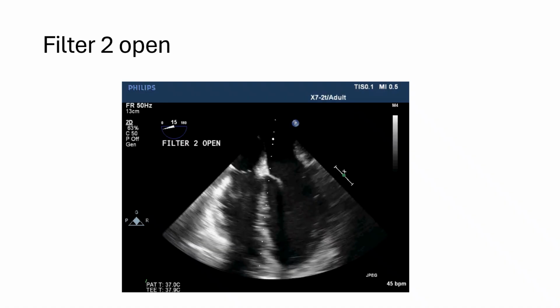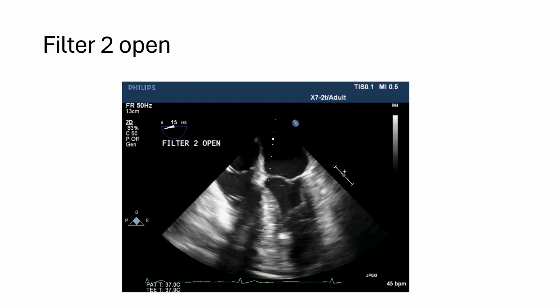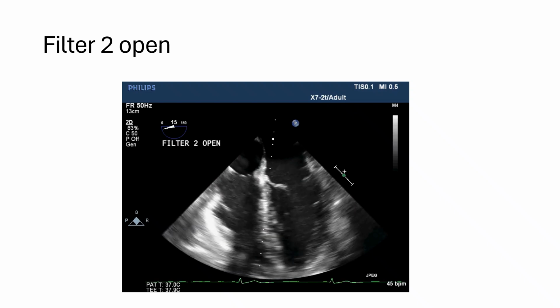And that's despite ongoing vasopressor support with boluses of epinephrine and vasopressin. Once we started to overcome the deficiency in preload, the amount of pressor use went down. However, we still use a good amount of infusion with epinephrine, in this case vasopressin, and bolus on top of that.